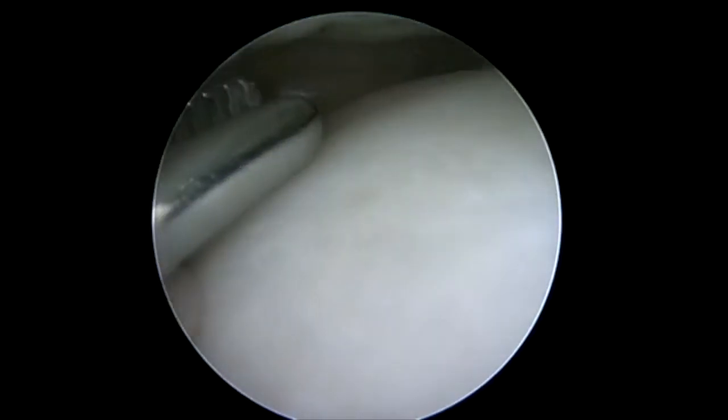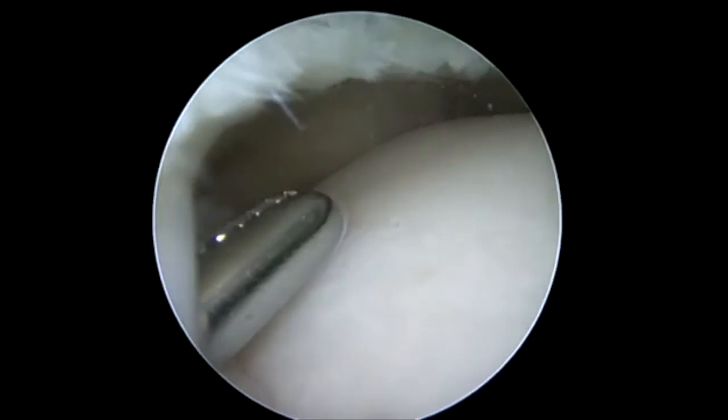So here comes our hemostat to make sure that we puncture through the meniscal capsular junction. I could have delivered a suture right at this point and simply dropped it, retrieved it over the top, and tied a simple stitch. Or in this case, I'm going to pass the NovoStitch lower jaw through that rent and then fire into the upper jaw and tie.